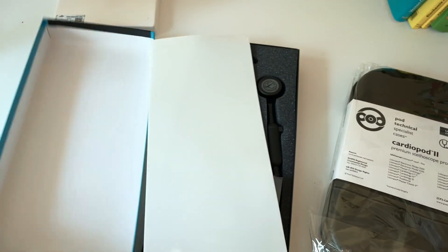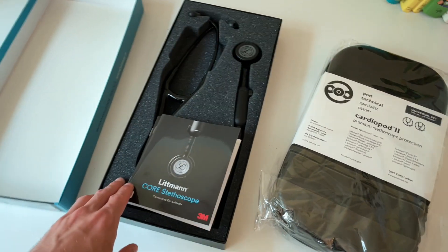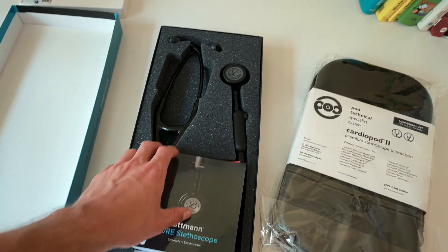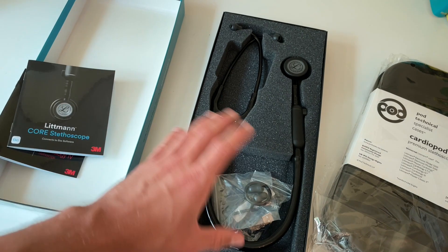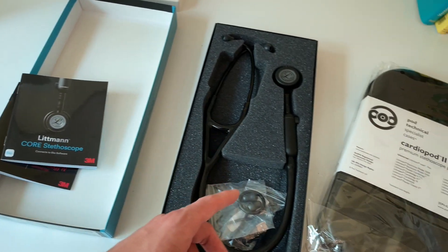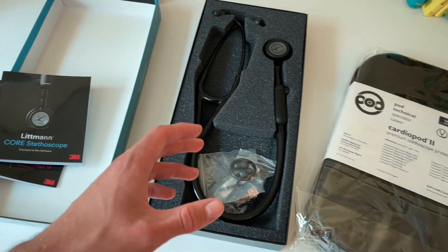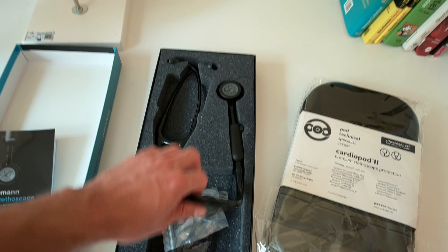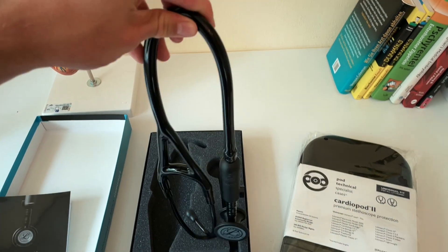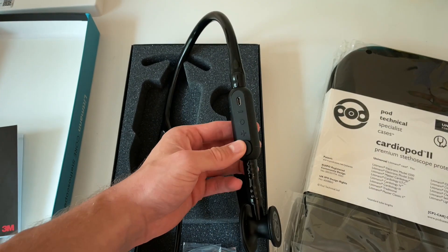So if you open this, you can see that all you get is this stethoscope right here and some extra papers. The reason it's a little bit messed up is because the first time I recorded this, my microphone didn't work. Anyway, this is the stethoscope, and the reason this one is so special — or let's say so expensive — is because of this little thing here.